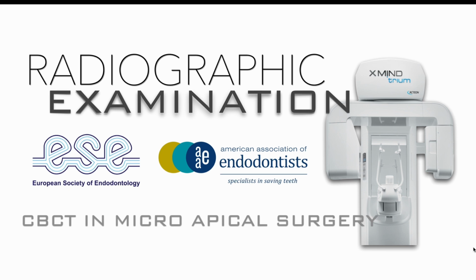So in my opinion, if I would choose between having a CBCT before the surgery or not, of course, every time I would love to go in with a CBCT, but there are some surgeries I did without any kind of CBCT, and these surgeries are mainly in the upper central when we have an obvious problem, like a broken instrument in the apical area which is extruded outside, and so on.